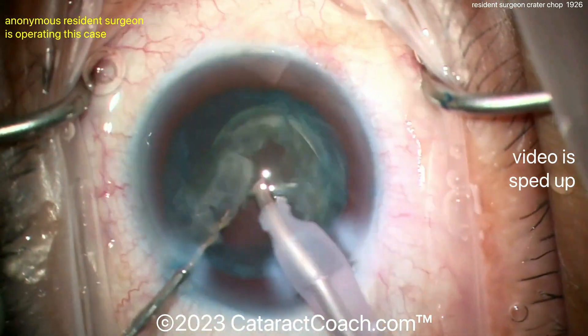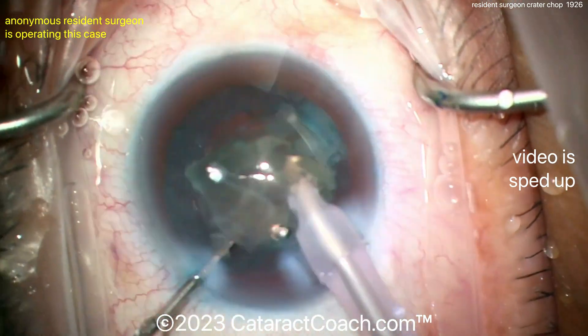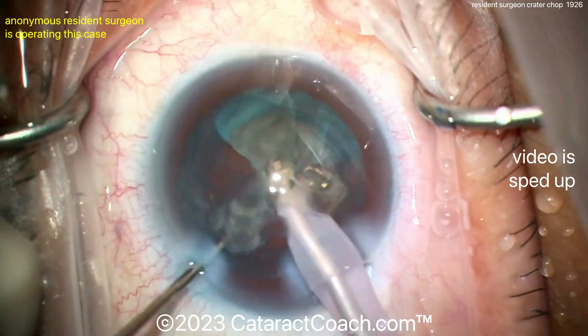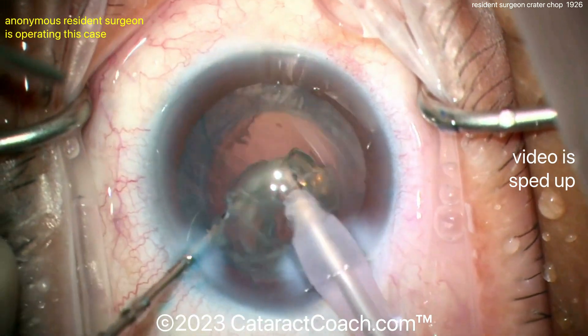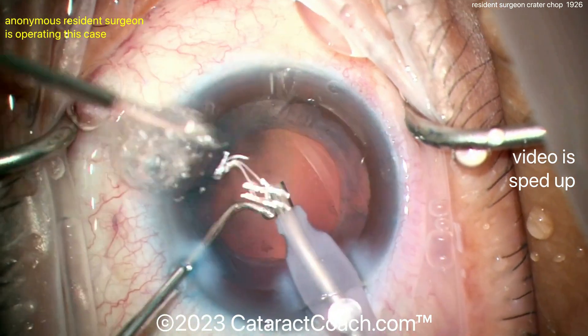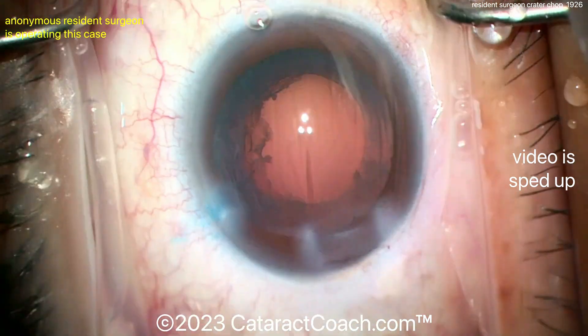A few little pieces left and those come up nicely as well. The video is sped up, but those pieces come out pretty nicely. This case is probably around 20 minutes, plus or minus, which is very reasonable for about case 100. Even if it takes 30 minutes, as long as you have a nice clean beautiful case, it doesn't really matter.